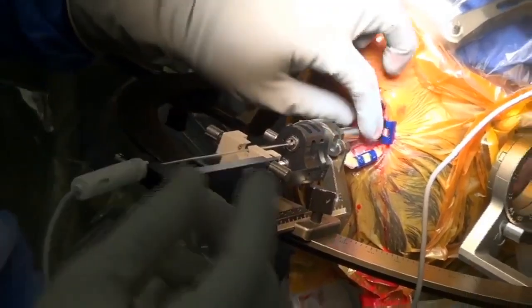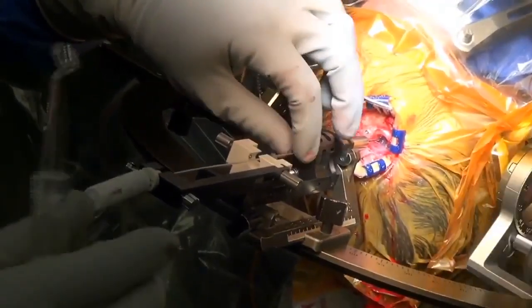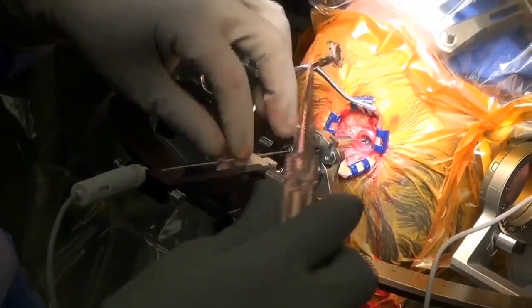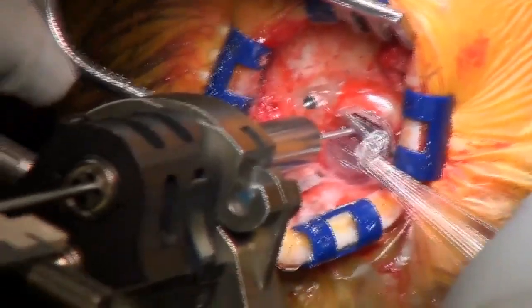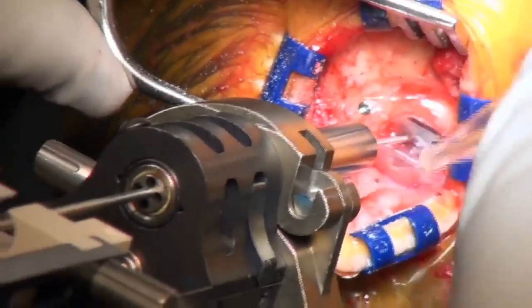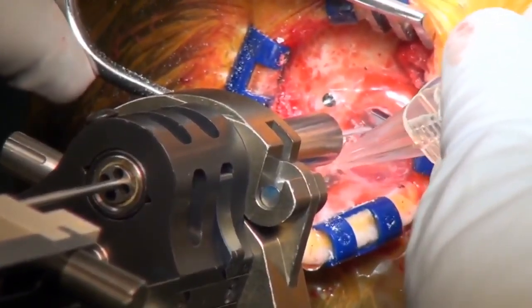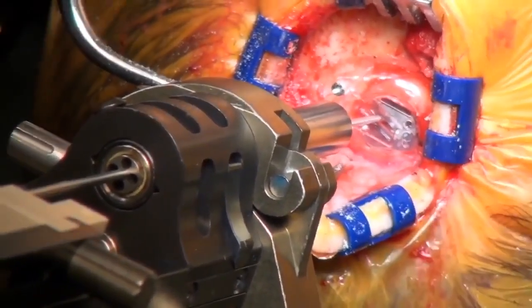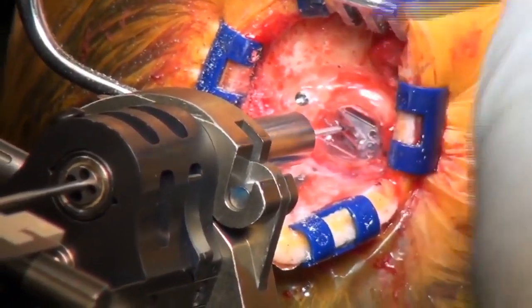Okay, there we go. And then let's get the clip. We're going to check the circuit right now. That's what this little thing is for. Leilani's about to check the circuitry. This is the clip, so called the Pac-Man. Close that. So that's the first step in locking this in place. That looks good. Mark that.